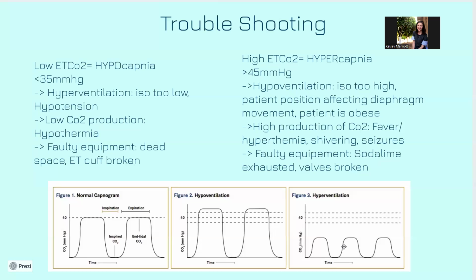We might have over intubated and gone too far down the bronchi, and so we're only able to affect one lung with our gas inhalants. That's where we need to do some troubleshooting.